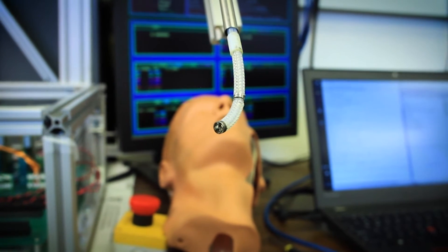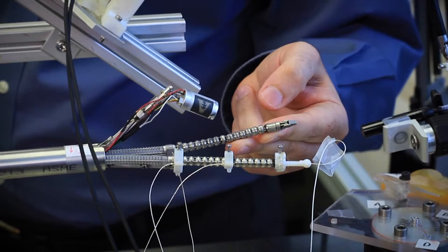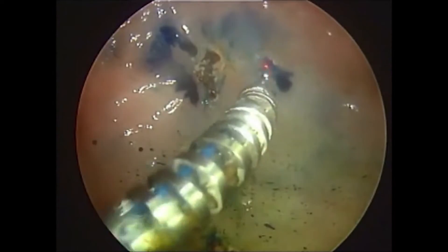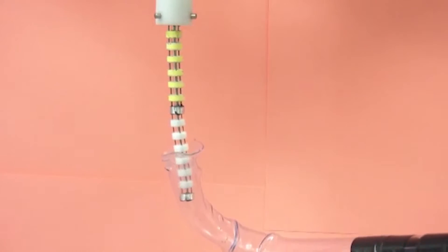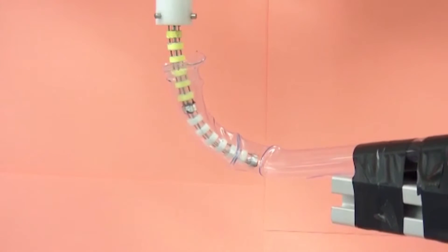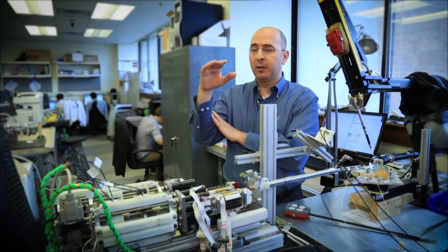Vanderbilt biomedical engineer Nabil Saman makes flexible snake-like robots that are situationally aware. What's special about them is that they are also able to sense the environment, helping surgeons navigate with as few incisions as possible. They're also able to sense that there's a contact and they're able to estimate what contact is, just like we are able to do with our own arms.